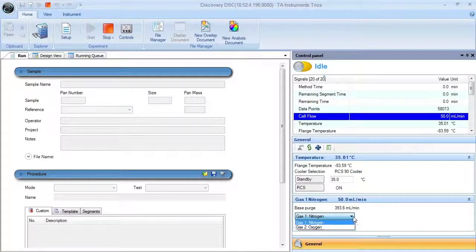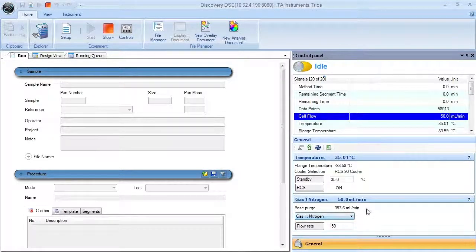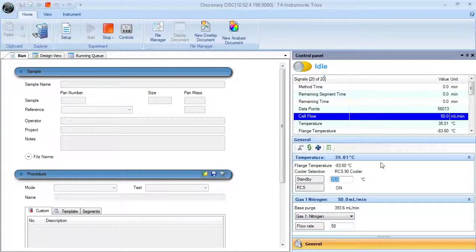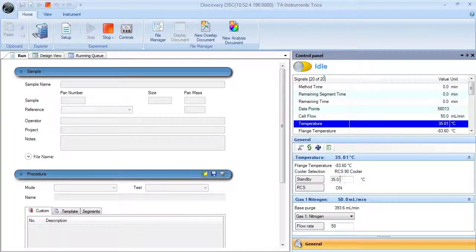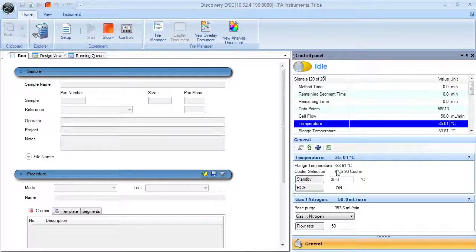The standby temperature can also be edited if needed, and the flange temperature can be monitored before and during the experiment.